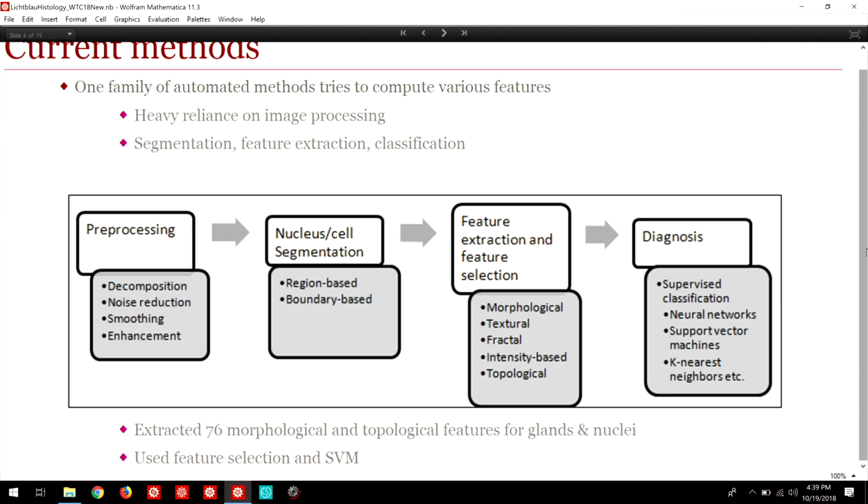That would be the Voronoi diagrams and Delaunay triangles. And for all these, of course, again area and perimeter and different dimensions, we ended up with 76 measurements, having also average, median, minimum, maximum, and so on. So different statistics about each measure.